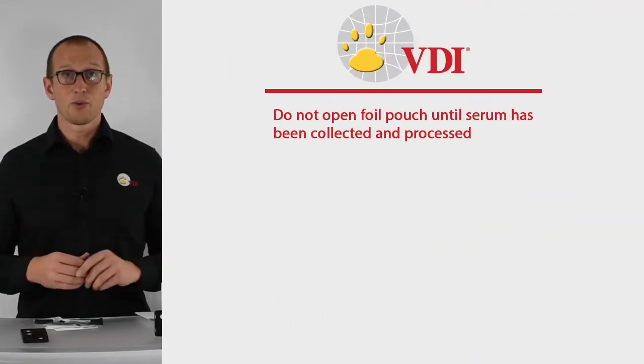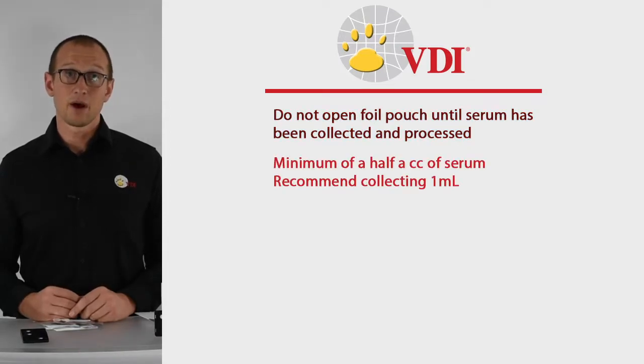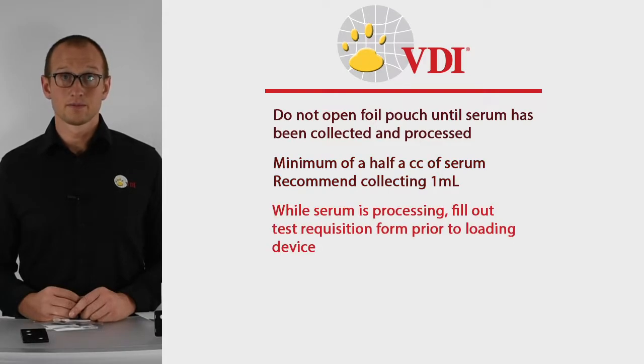Please do not open the foil bag until serum has been collected and processed. This kit requires a minimum of a half cc of serum, but we suggest collecting one ml. While serum is processing, completely fill out the test requisition form prior to loading the device.